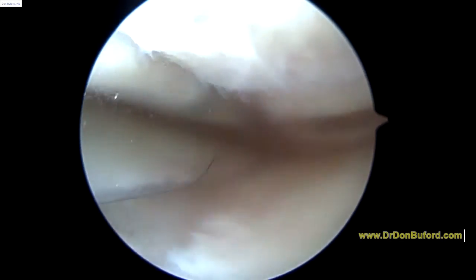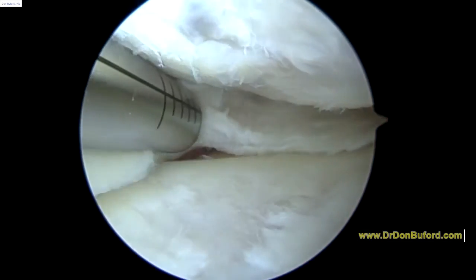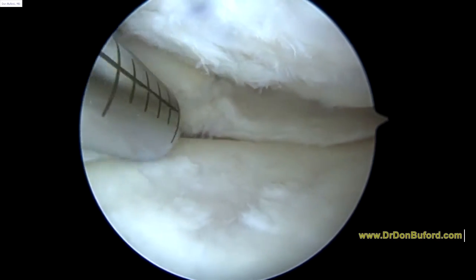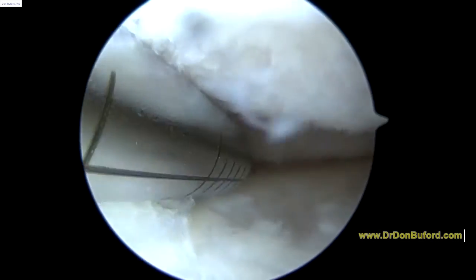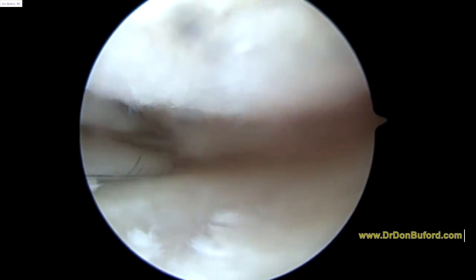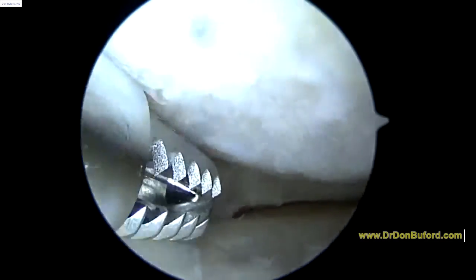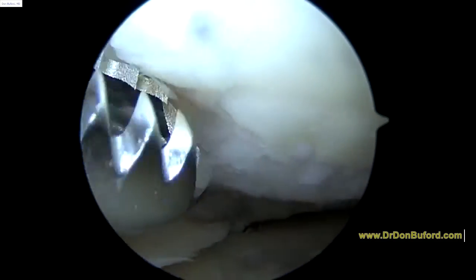Now we're just trying to smooth out the edges here. So we're all done with the medial meniscus. I don't think we want to trim back any more — I think we've gotten everything that is either unstable or about to be unstable. The more significant finding in this compartment is the arthritis. Here's a little bit of damage, more damage on the femoral condyle.